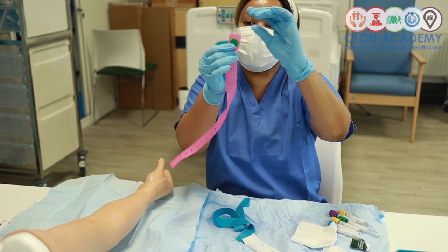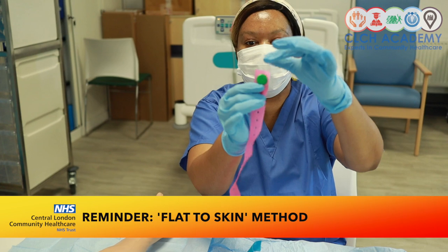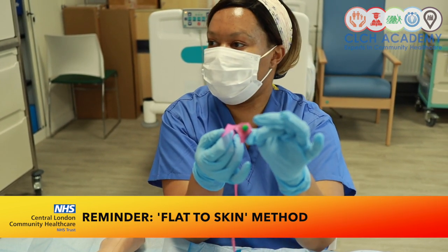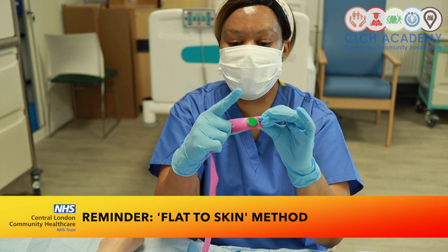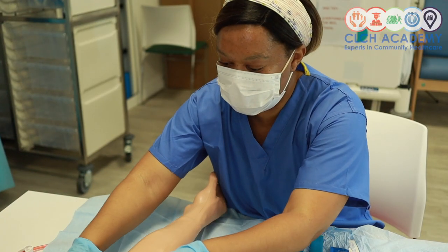Usually the pink tourniquet has what looks like a green button. Hopefully that's visible to you. It's got both the flat side and the slightly knobby side on the inside. An easy way to think about this in terms of application is that the flat side needs to connect with the skin. So flat to skin.